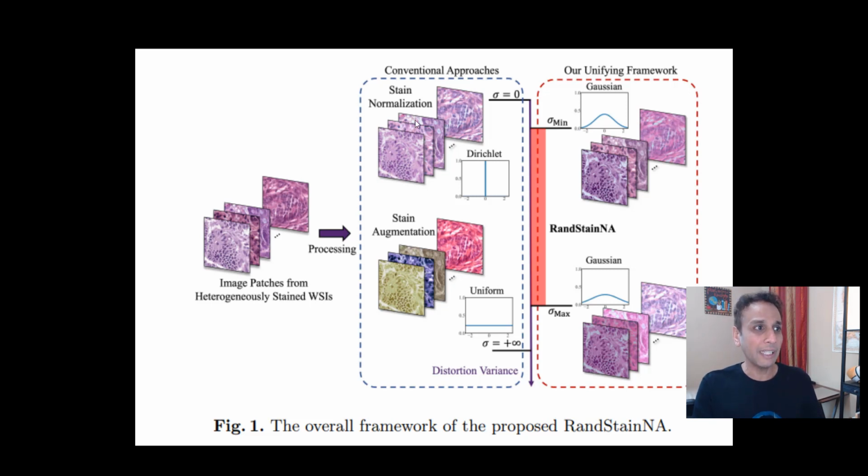So they're combining that with stain augmentation, because if you just do stain augmentation, whether you're using torchvision or TensorFlow for your augmentation, your images can be augmented in color, like in yellow, blue, all these different spaces, but in reality that's not reflecting your real life scenario.